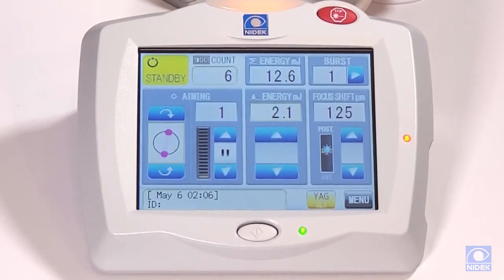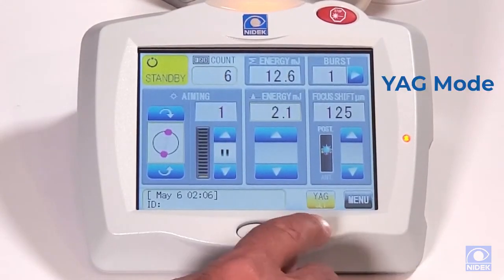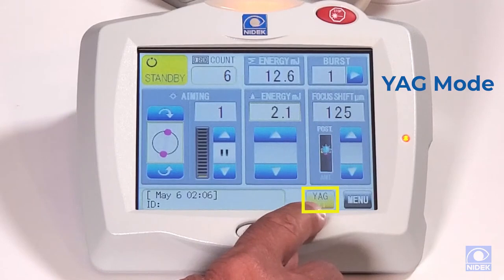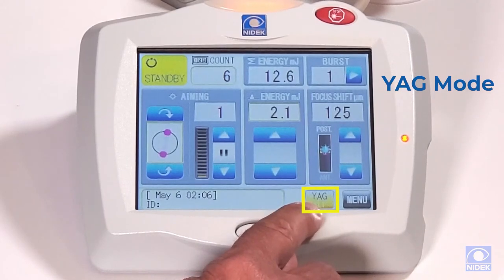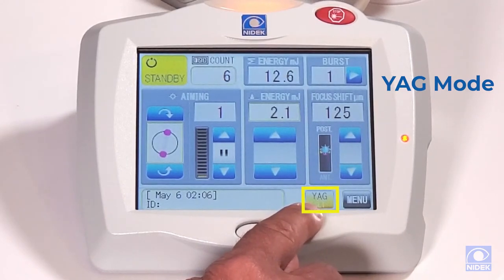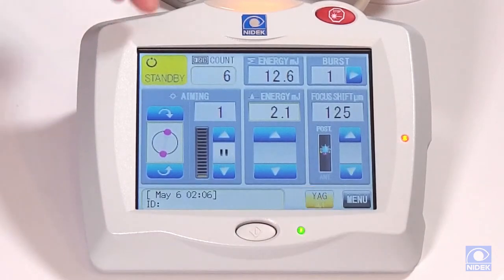First I'm going to show you how to set up your treatment parameters in YAG mode. As you can see on this tab here, we're already in YAG mode. This is where you can change back and forth from YAG to SLT. So we're going to stay in YAG mode.